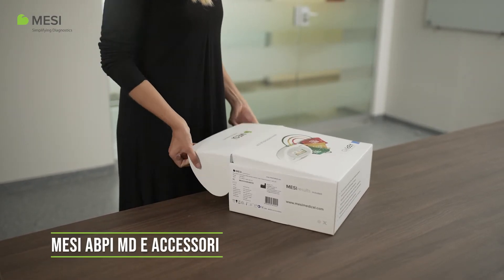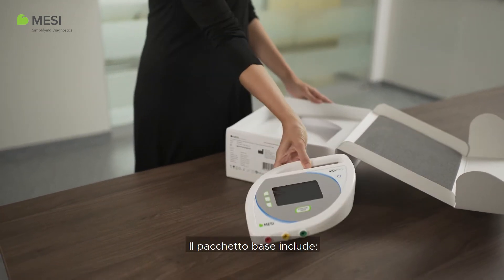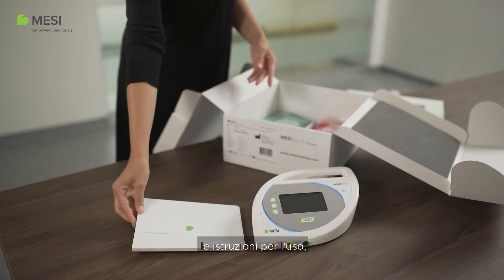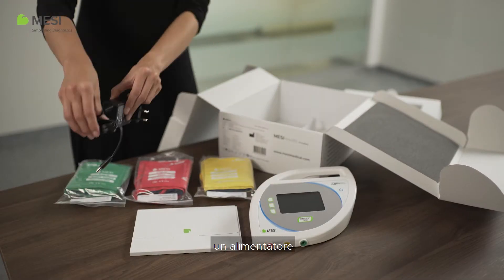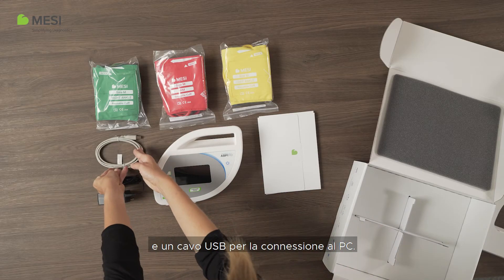Macy ABPI-MD and accessories. The basic package includes the ABPI-MD device, instructions for use, M-sized cuffs, a charging cable, and a USB cable for PC connection.